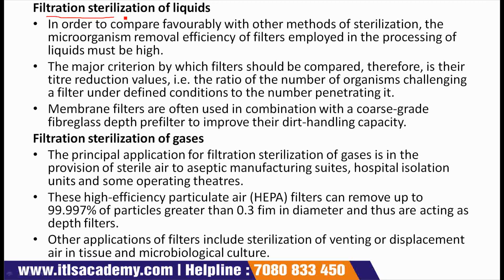Filtration sterilization of liquids. First point, in order to compare favorably with other methods of sterilization, the microorganism removal efficiency of filters employed in the processing of liquids must be high.